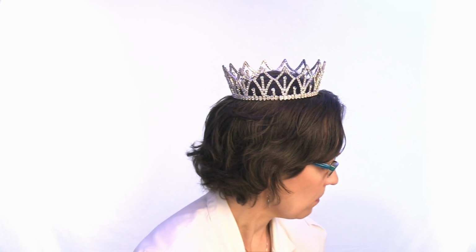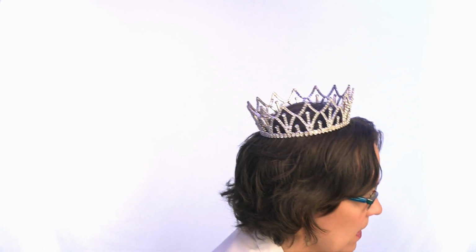So first of all, what is a pessary? A pessary is a silicone device. I always want to call it a thingy. It's a silicone thing that you wear at the top of your vagina to help hold prolapsed organs in place. So I have some examples I'll show you. We have some different sizes and shapes of them here.